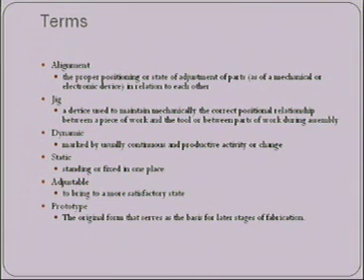And then we have adjustable. Adjustable is to bring to a more satisfactory state. So whenever you hear something's adjustable, the purpose of the adjustments is so you can make it better. And that's what we do with a lot of our adjustable componentry in prosthetics: we adjust the prosthesis so it's better for the patient. So adjustability is really important for us in prosthetics.